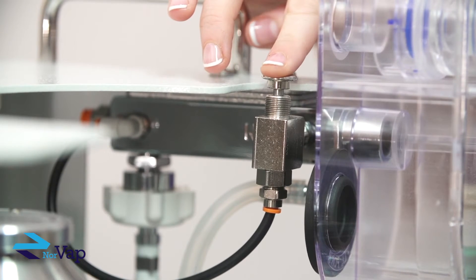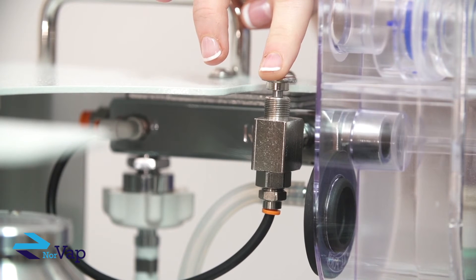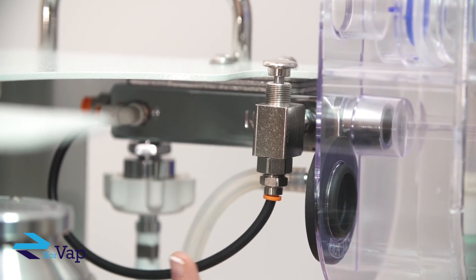Next to the flow meter you will find the oxygen flush valve. The purpose of the O2 flush valve is to deliver high volumes of O2 to the breathing circuit and the patient. Gas from the O2 flush valve does not travel through the vaporizer, but instead bypasses it through an independent tube which meets with the output from the vaporizer just before entering the breathing circuit.